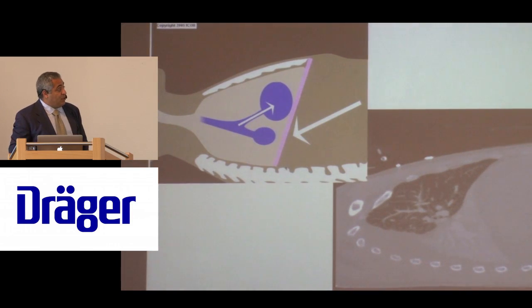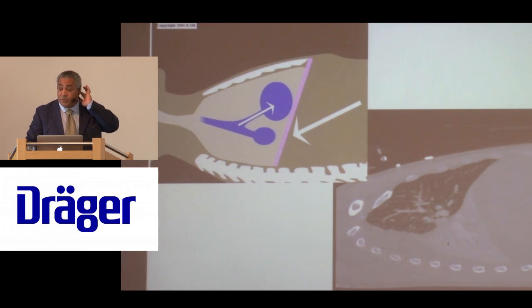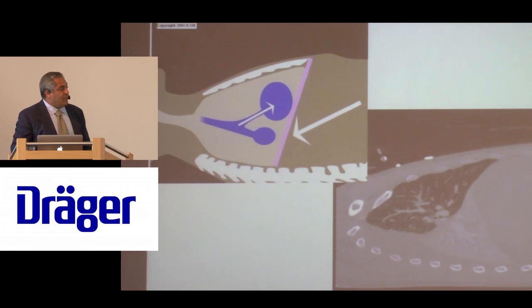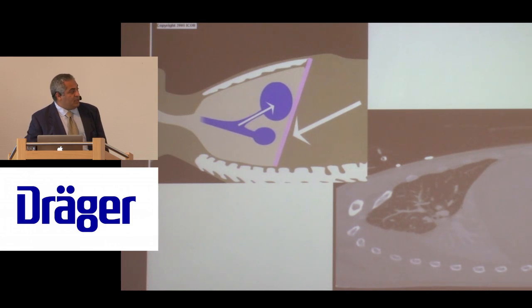This is actually one of my patients that was undergoing a 4-hour abdominal procedure for trauma, and had some problems towards the end of the procedure, could not complete the procedure, went to CAT scan, and you can see the lung is really healthy. Looks pretty healthy on CAT scan, except the entire dependent part of the lung is collapsed.